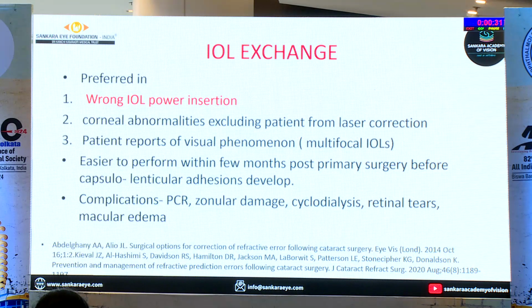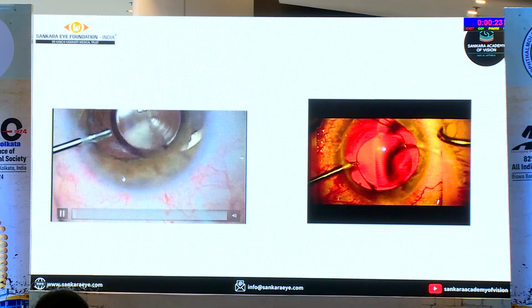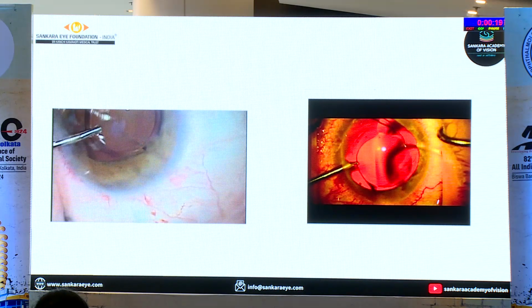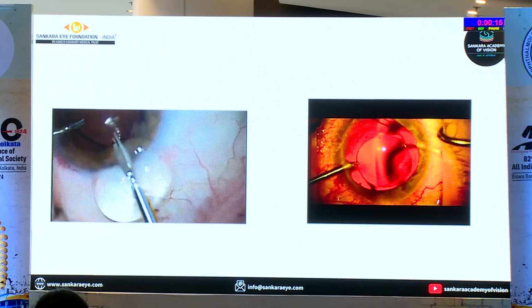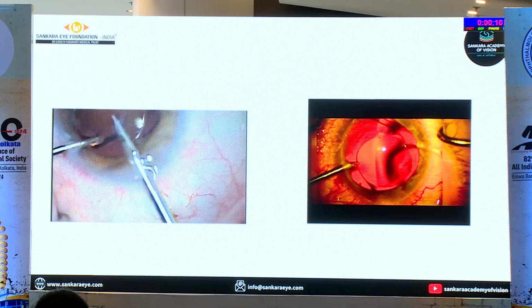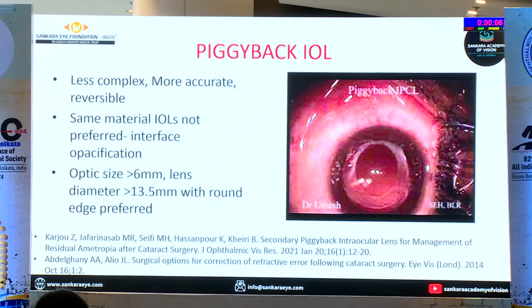But if it happens, Dr. Arup has shown beautifully how to cut. I have some videos, but Arup has shown very beautifully. Essentially, you have a complete cut, a partial cut and rotate, and a pie cut, beautifully shown by Dr. Arup, and rotate and remove. So I will not go much into it. And emphasis, yes, emphasis on the type of cutting instrument, the forceps that you need.